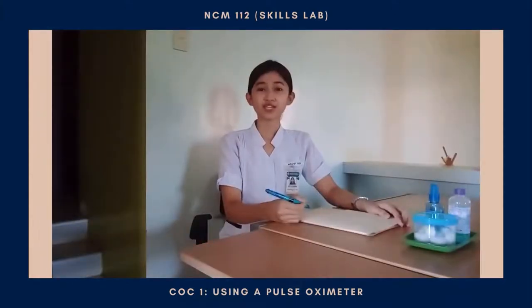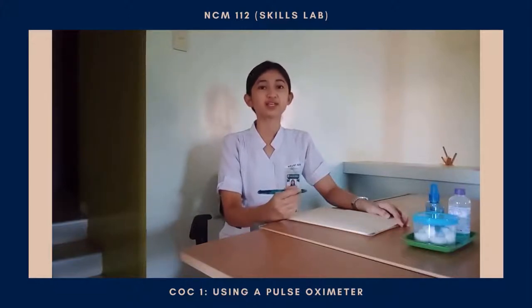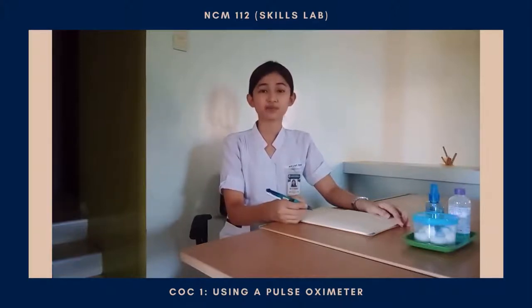For the implementation, first we need to review our patient's chart for any health problems that may affect their oxygenation status. This will give us an idea if their condition is improving or if it is deteriorating. Examples of health conditions that may affect their oxygen status include any heart and lung problems, or any condition which requires them to take a vasoconstrictive medicine.